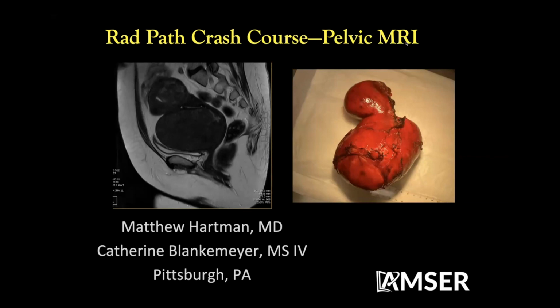Katie did a women's imaging rotation with us and did a fantastic job. And she made the comment that a lot of students, a lot of attendings in GYN don't know how to read a pelvic MRI, but would like to learn. So Katie did a great RadPath case. You can see it right there. And we are going to use that as an example for how to get comfortable reading a pelvic MRI.